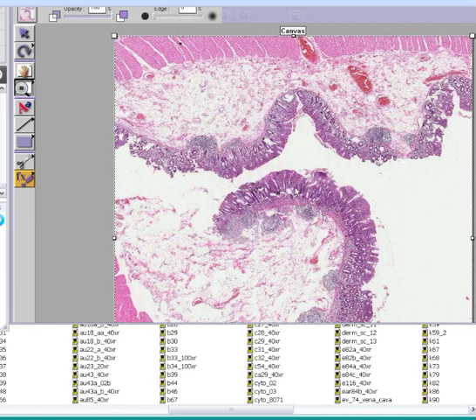This is ulcerative colitis. Now, whenever you see primary inflammatory bowel disease, you have to differentiate whether it's Crohn's colitis or ulcerative colitis. We said that with Crohn's colitis, if you look well enough, you'll probably find granulomas because another name for Crohn's colitis is granulomatous colitis. We didn't see any granulomas, but we saw ulceration and we saw crypt abscesses.